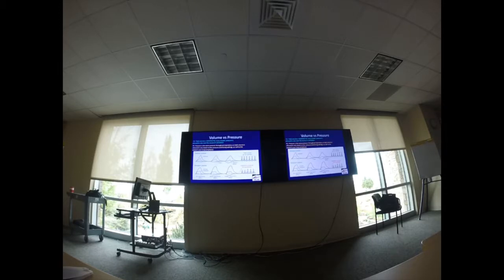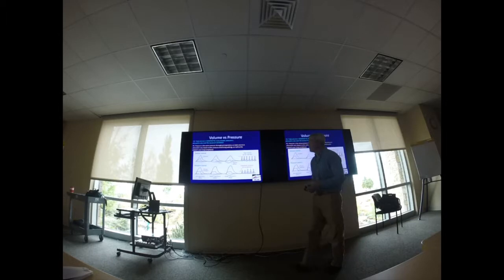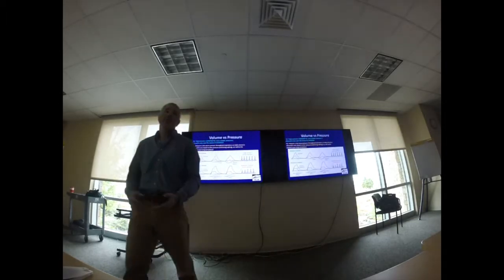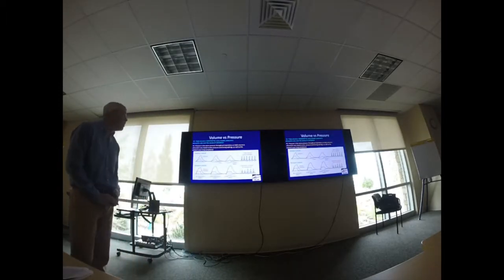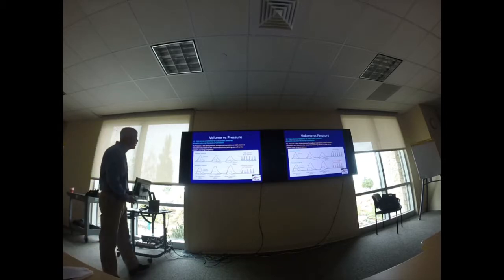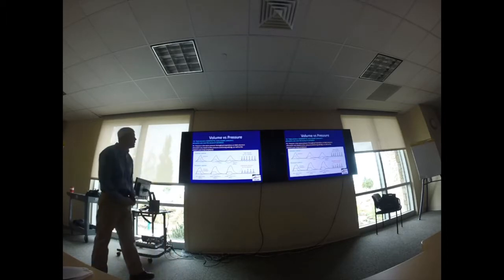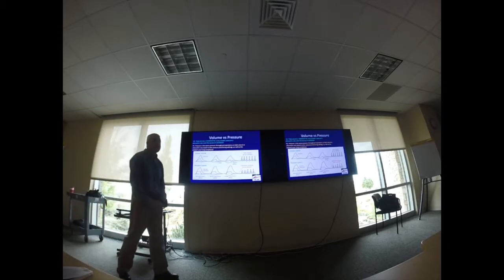So I think when you talk about intubating somebody and putting them on a ventilator, and when you're new to ventilation, you really just need to go through some general concepts. That's what I'm going to try and do right now. We're going to talk about volume versus pressure. In volume mode, volume control, the tidal volume is constant for every breath. Pressure is allowed to vary over the course of ventilation.